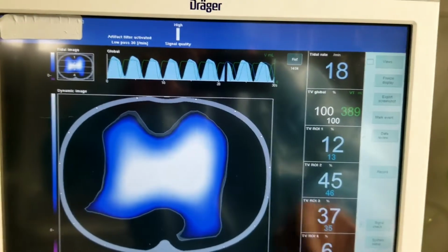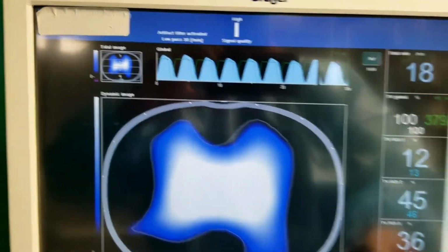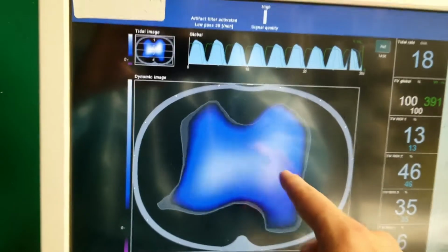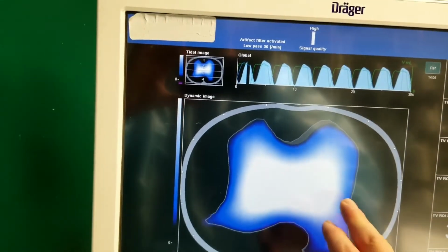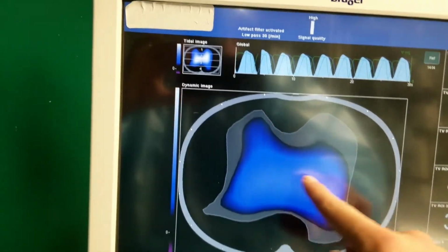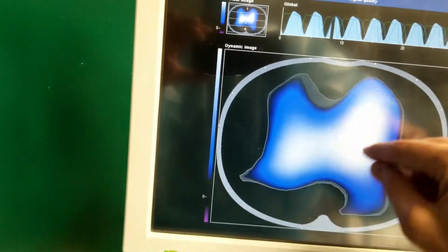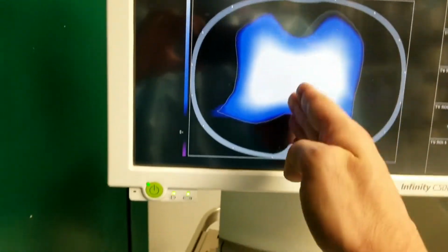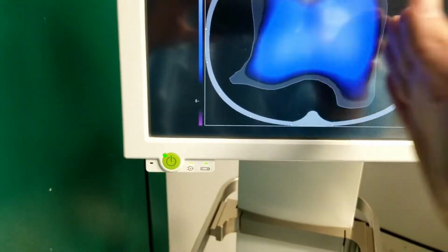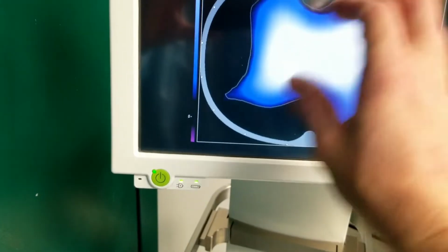So I'm hoping to start seeing higher percentages coming up here overall. One of the good things, though, is that it's well distributed, that maximum ventilation. When you compare it to the other one, up here was maximum, there's blue coming down here, but it was a white concentration. This at least seems to cut right in the middle. There is an even distribution of that maximum ventilation. There's not a blotch anywhere.